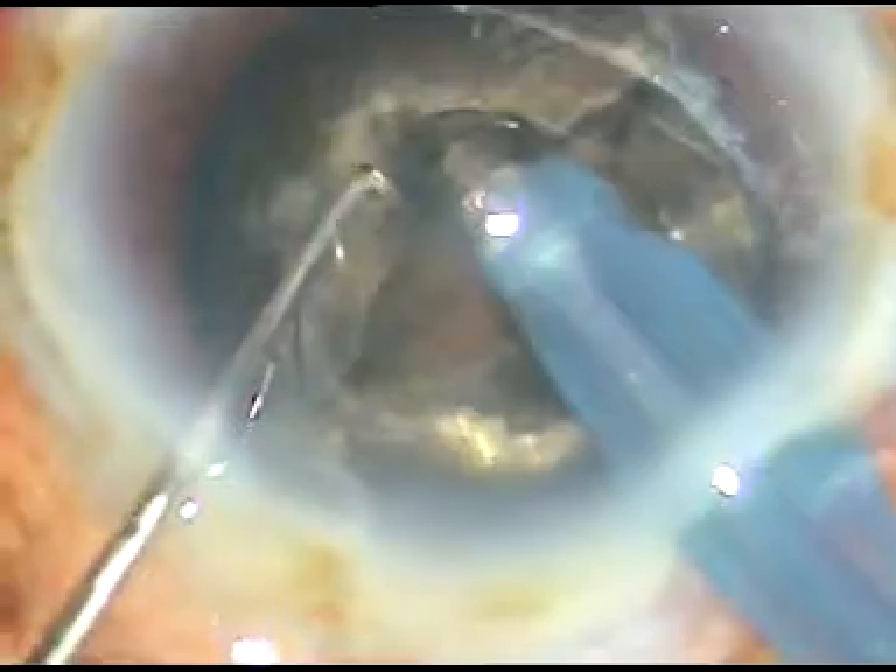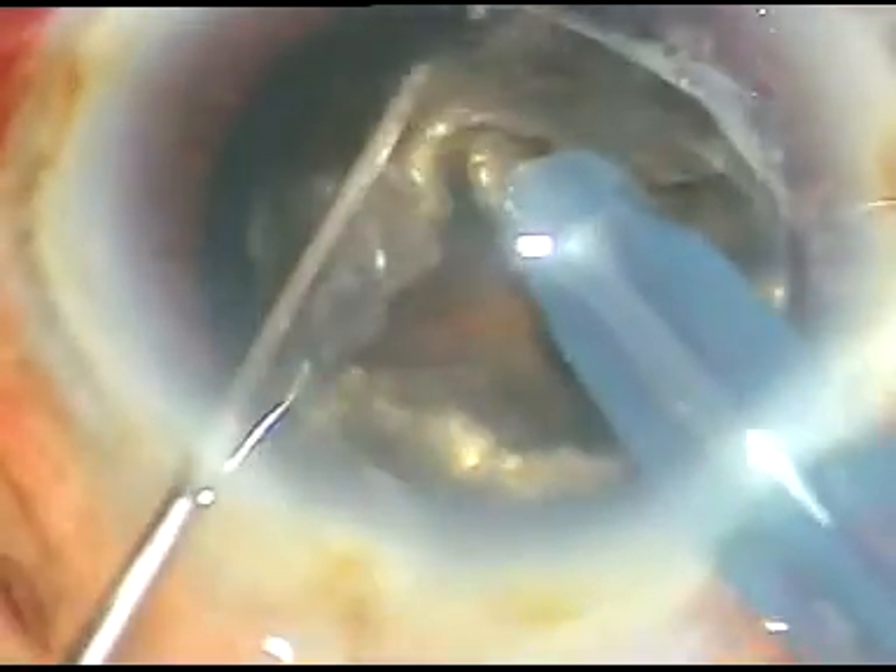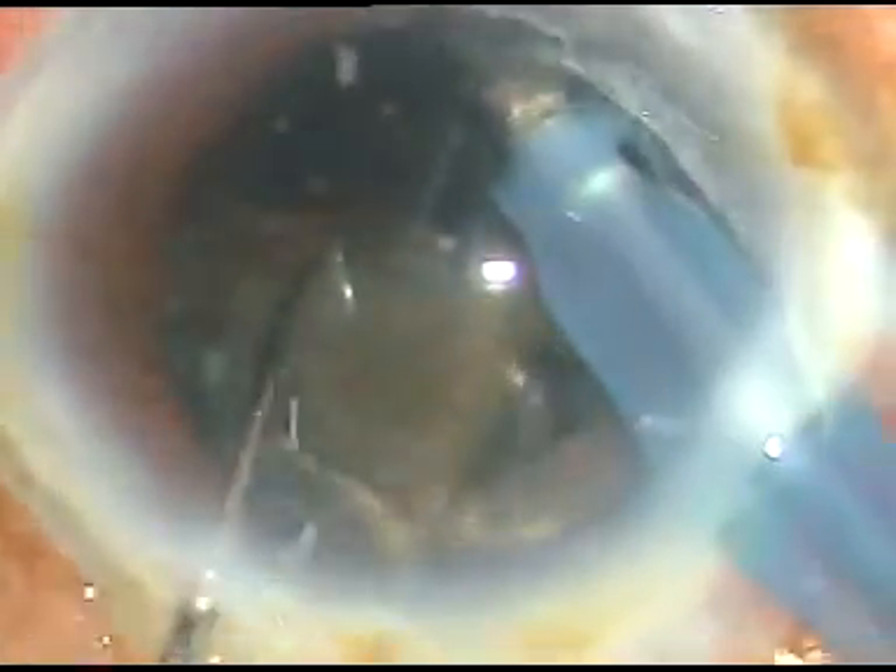Once this hard nucleus divides into two halves, you are almost through. I have been able to chop one hemi-nucleus into two parts.